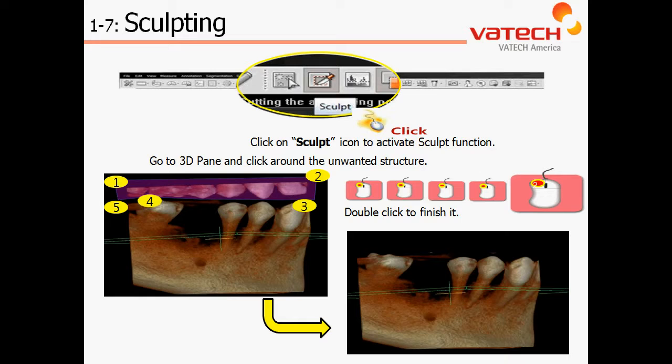At this point in time, pause the video and access the 3D software to replicate the steps of the sculpting tool itself.